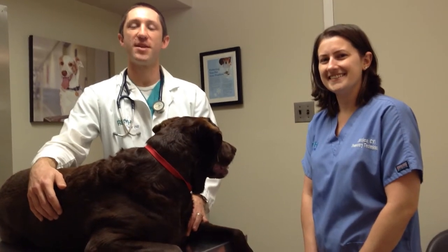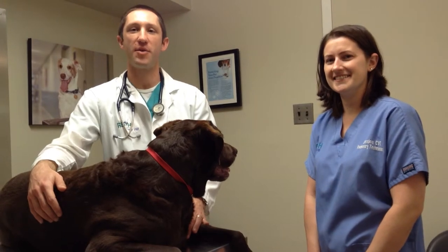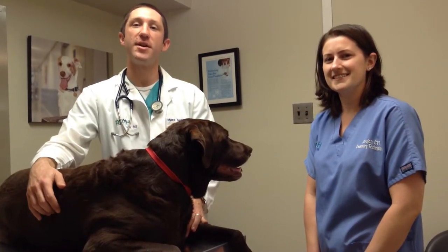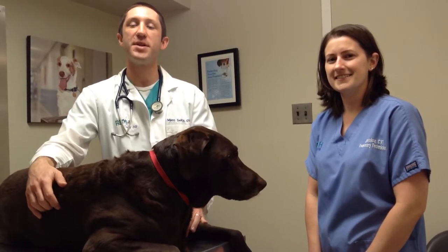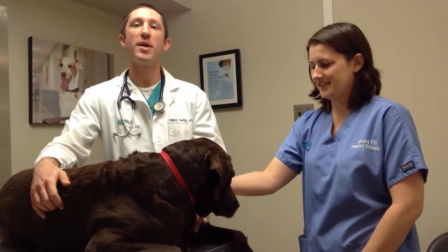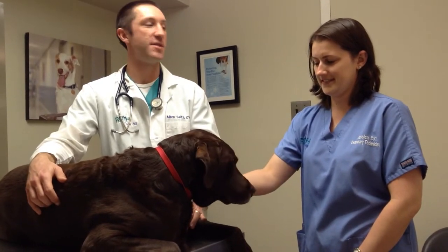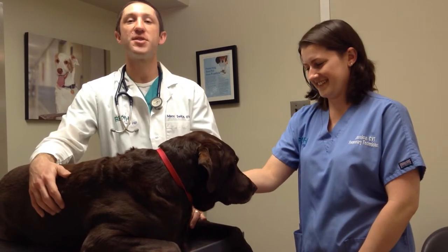My name is Mark Seitz and I'm one of the emergency clinicians here at Red Bank Veterinary Hospital at our Cherry Hill location. Today we're going to be discussing specifically the various types of e-collars and how to put them on your dog. Please feel free to check out our first video where we discuss why an e-collar is important and how to use it. I'm joined today by two very important helpers: one of our licensed technicians, Jess, as well as my own personal dog, Sedona.